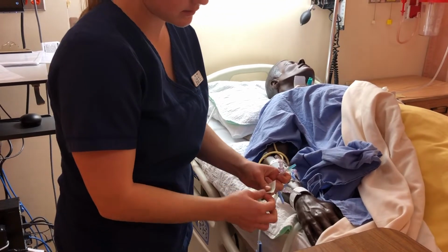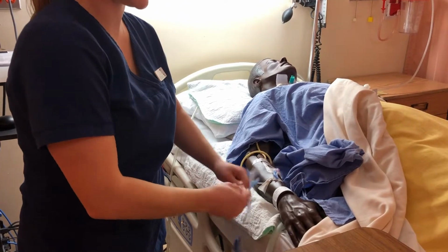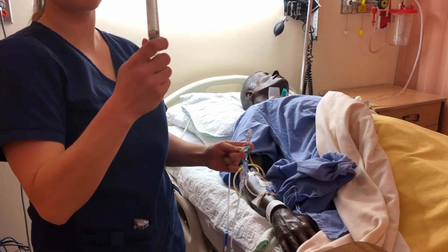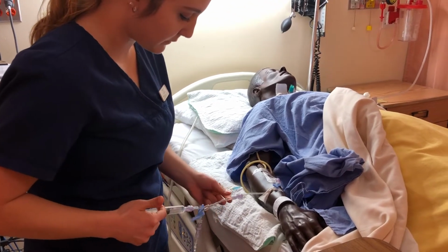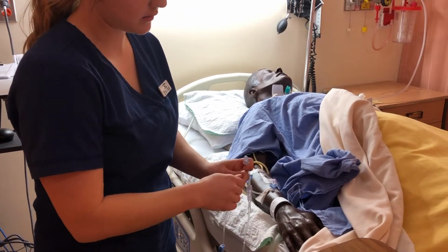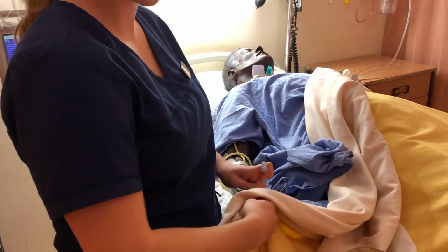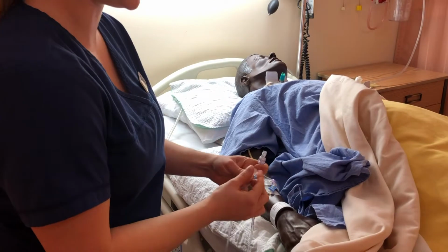And alcohol swab for 30 seconds and let it dry for 15. Make sure my clamps are open, my line is patent, okay? And now I'll be, if I can open it. Okay, my hands are a little wet. This would not be sterile. Okay, so I would swab this just to be safe.